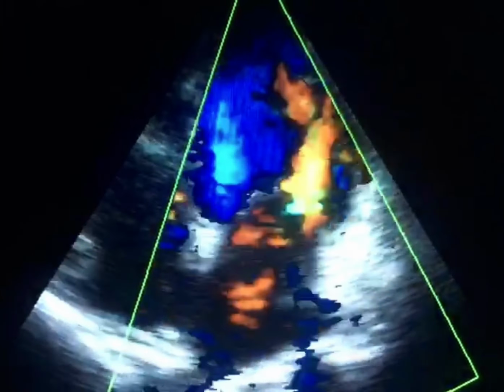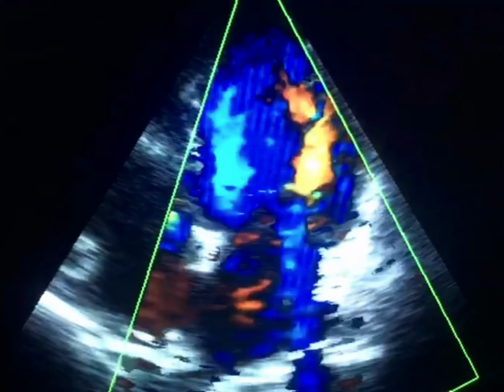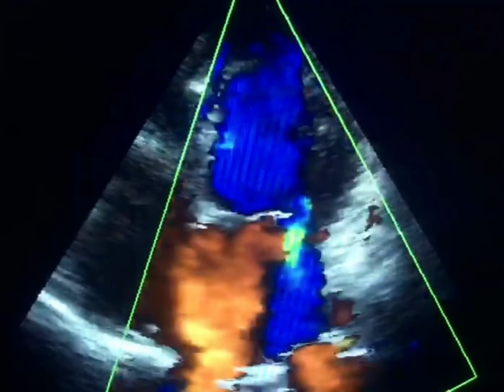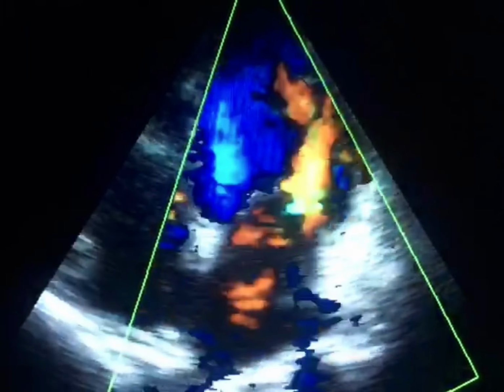Mitral regurgitation, MR. MR severity is often assessed using multiple criteria, including jet area, vena contracta, and flow reversal. However, one crucial factor that is often overlooked is the duration of regurgitation during systole. How do you estimate this MR severity? Have you considered the duration of MR when assessing its severity?